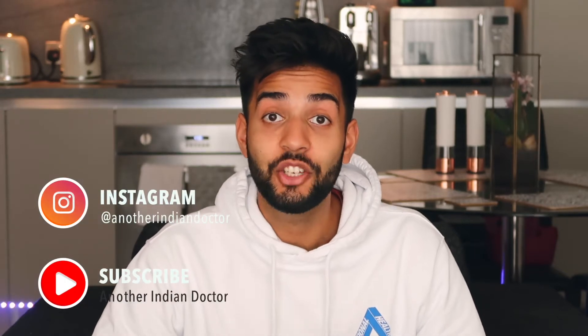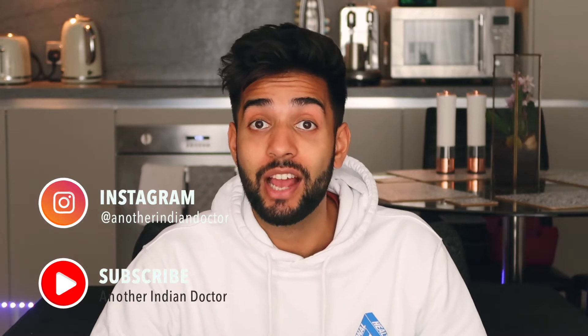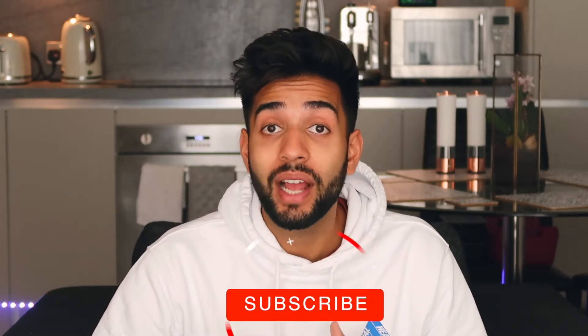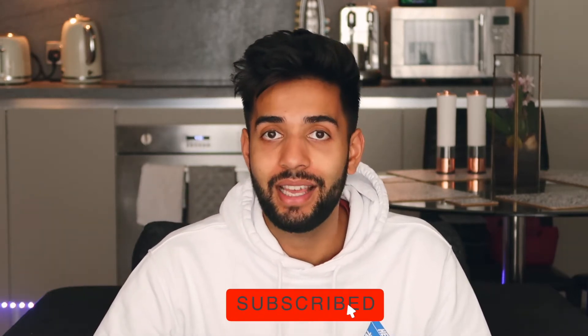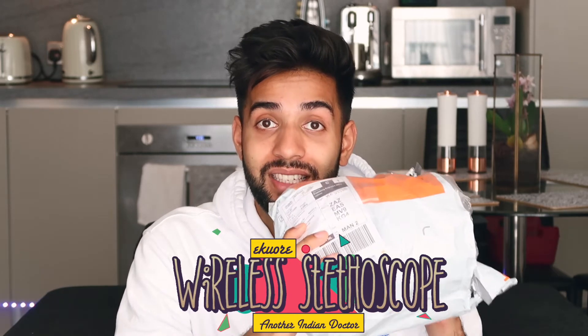Hi guys, it's Kieran, another Indian doctor, and welcome back to the channel. A few weeks ago I had a Spanish company reach out to me and they said would you like to try out our wireless stethoscope, to which I said of course. So it arrived in the post recently and I've not opened it yet, so today we're going to be unboxing their eKuore wireless Bluetooth stethoscope.